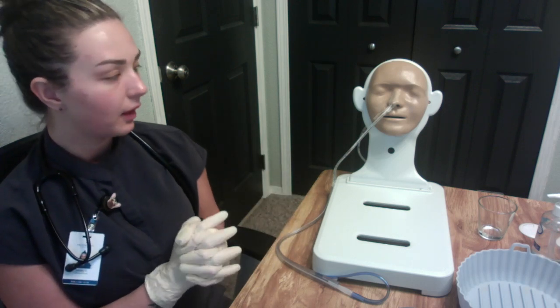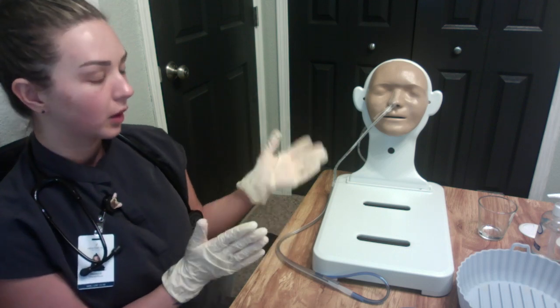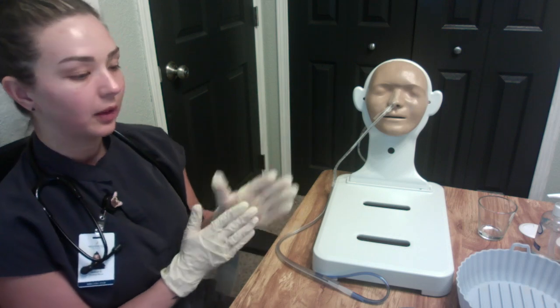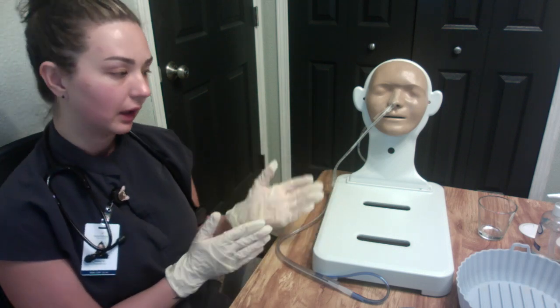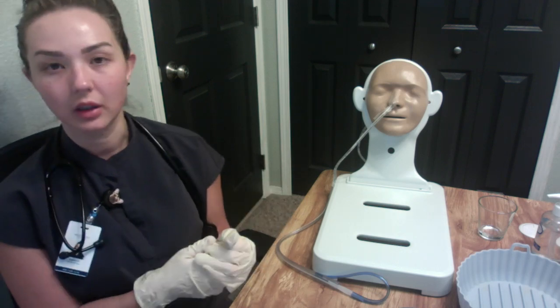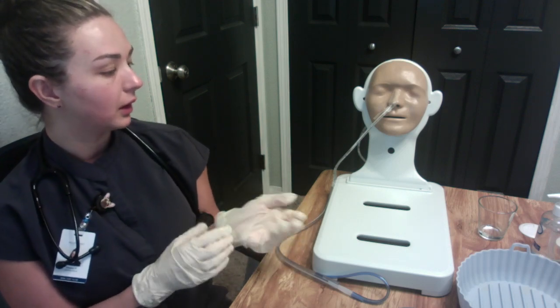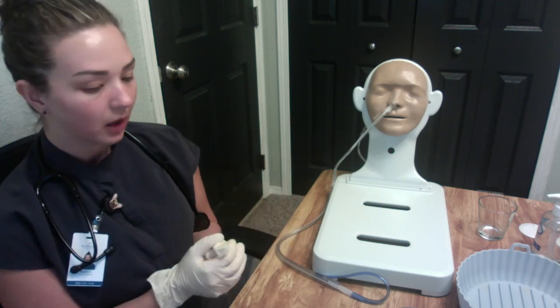So with that, we are done. Now, again, we would want to make sure that the patient is comfortable, whether we put them back in a reclined position or laying flat, depending on the comfort the patient needed. So after that, we would go ahead and clean the patient up.